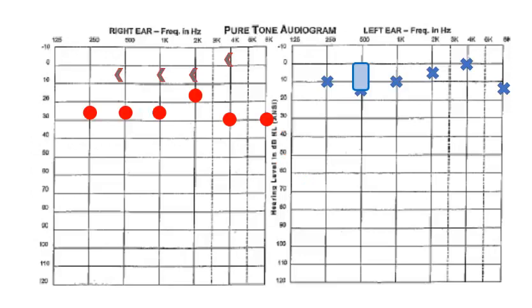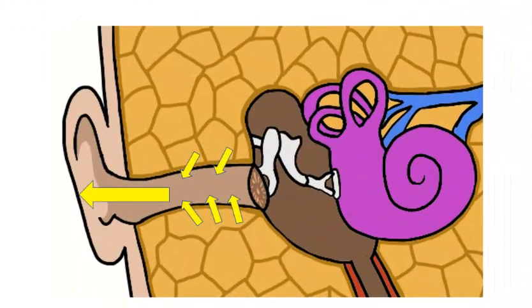Let's see what this looks like. Here's the compensation for the non-test ear hearing level, 15 dB. Here's the 20 dB compensation for the occlusion effect. And here's 10 dB of active masking. The total amount of initial masking is therefore 45 dB. This is not the final step as we need to plateau, but it does illustrate how we create the initial level during this method. What is causing the occlusion?